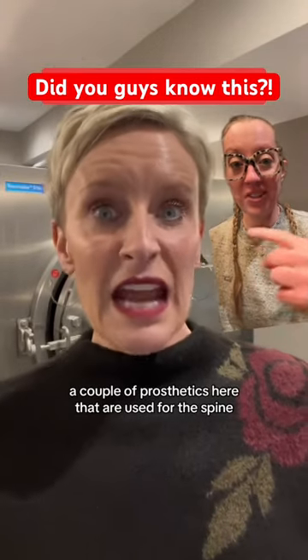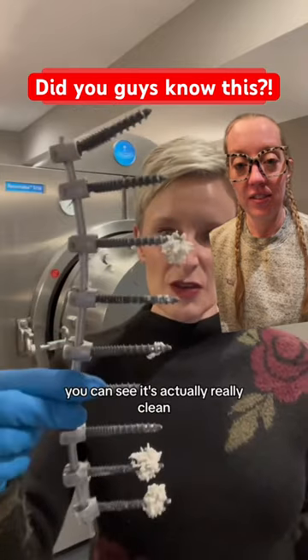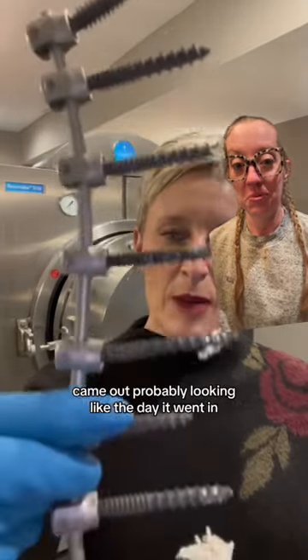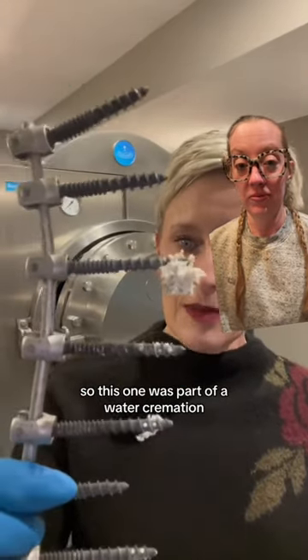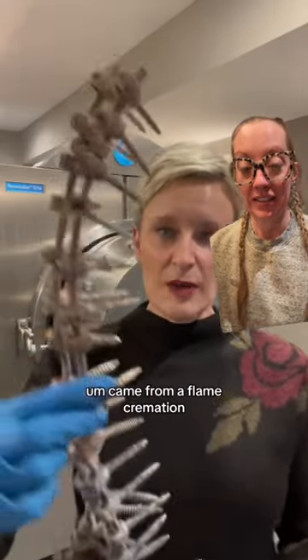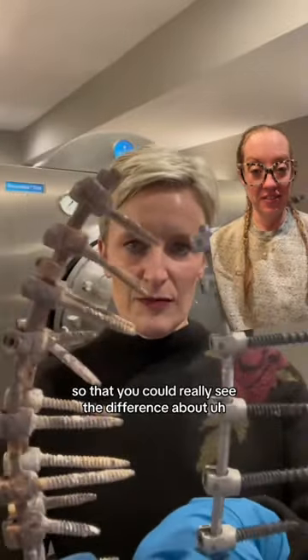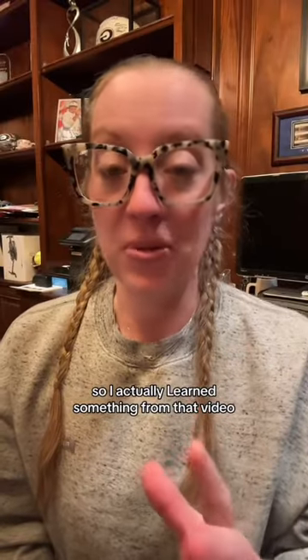Here are a couple of prosthetics used for the spine. This one came out really clean, probably looking like the day it went in — it was part of a water cremation. This larger device came from a flame cremation. I thought this was really cool so you could see the difference between flame cremation and water cremation.